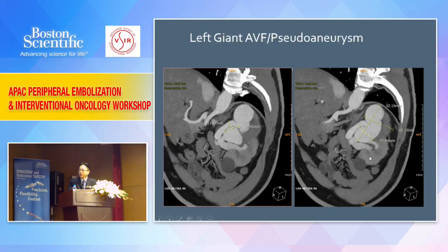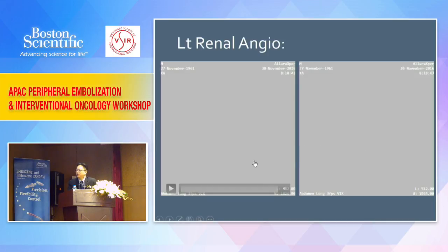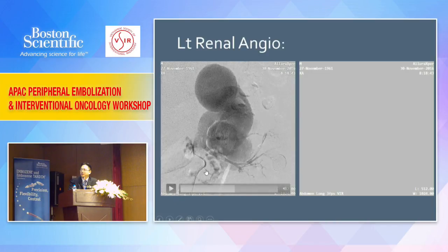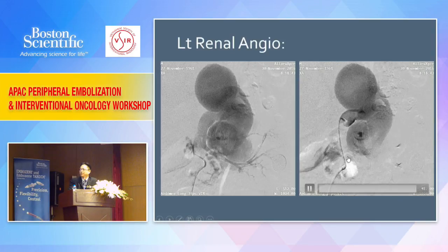with a large aneurysmal sac. Okay, this is the ultrasound. Sorry, this is post embolization. Where are all my pictures? Okay, again you have one like this, and what will you do? Well, my fault. I didn't prepare a vascular plug. We thought we would go in, use a balloon occlusion, then coil, right?